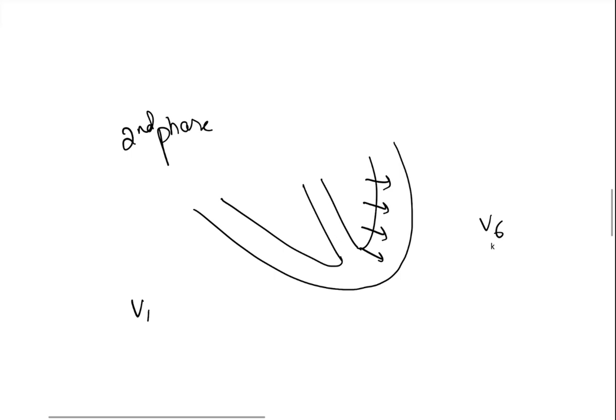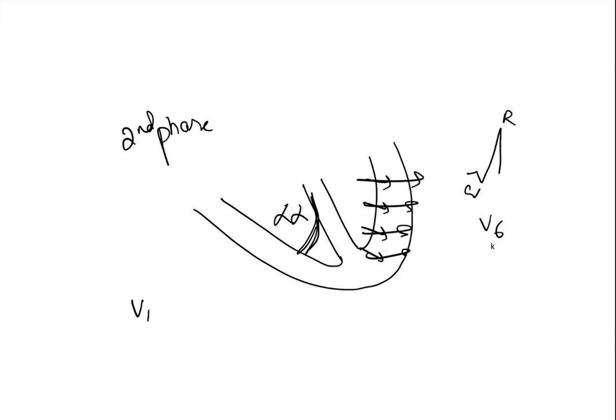So what exactly happens is, since there is an issue with your right bundle, and it's not proper or due to any organic cause, the left ventricular depolarization takes place. Since the current of depolarization is towards V6, after an initial negative deflection, you get a positive deflection. So this is the septal Q wave, which we learned. Now you get an R wave here, okay?